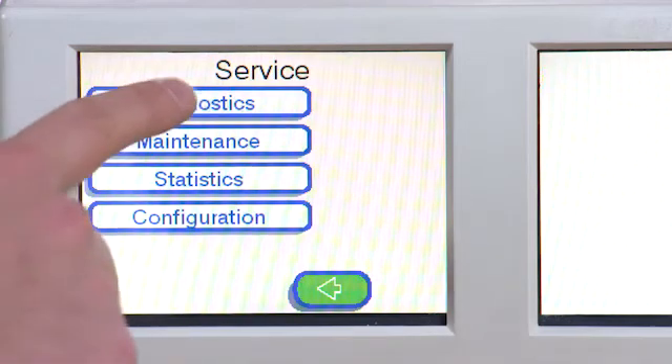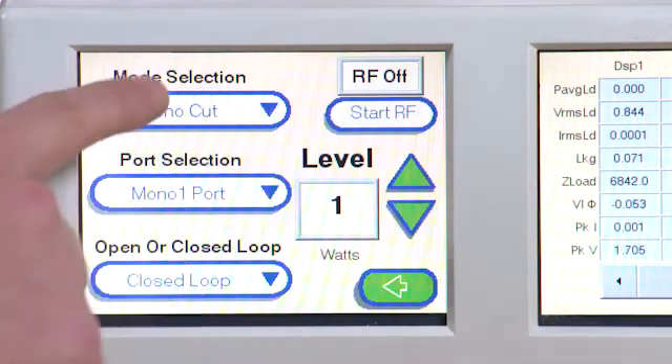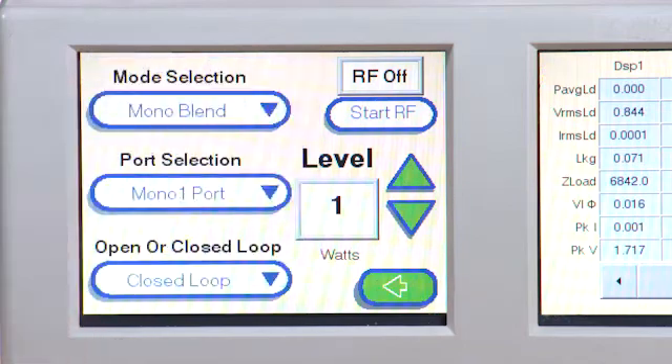Select Diagnostics and then Debug Mode. Select Mono Blend from the drop-down list. Choose Mono 1 and select Open Loop.